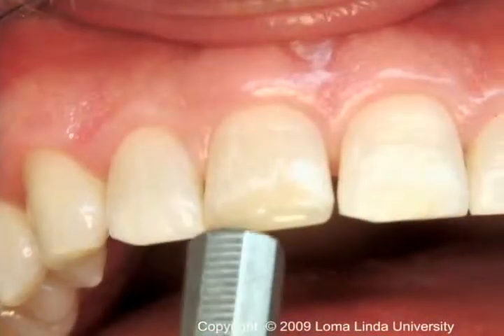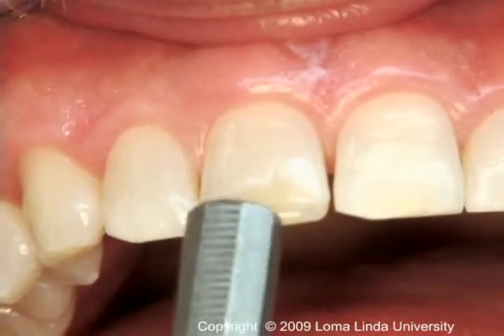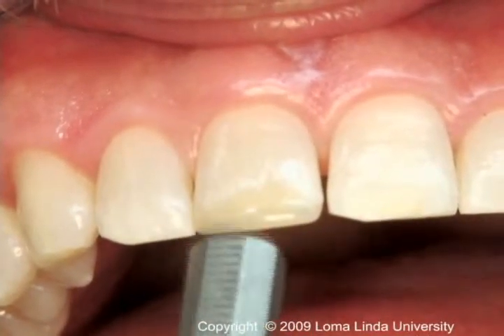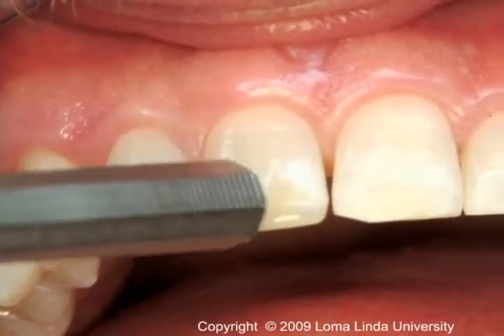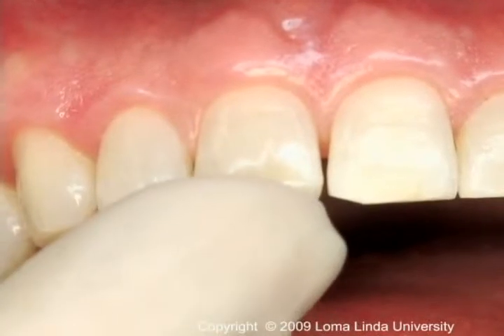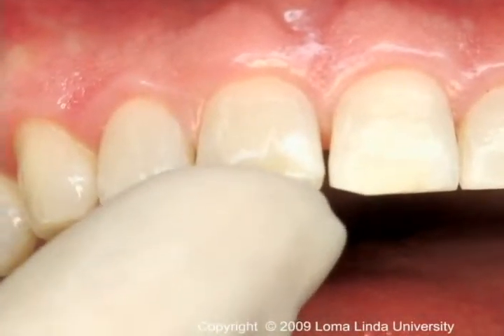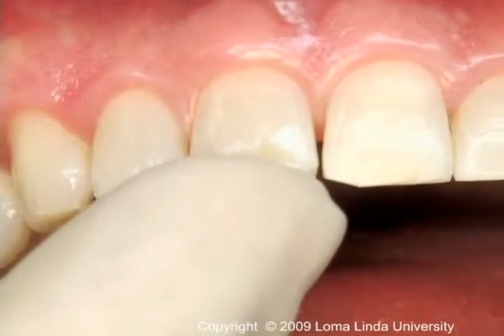Percussion is performed by tapping on the incisal or occlusal surface of a tooth with the end of a mirror handle, held either parallel or perpendicular to the crown. This test should be preceded by gentle digital pressure to detect teeth which are very tender and which should not be tapped with the mirror handle.